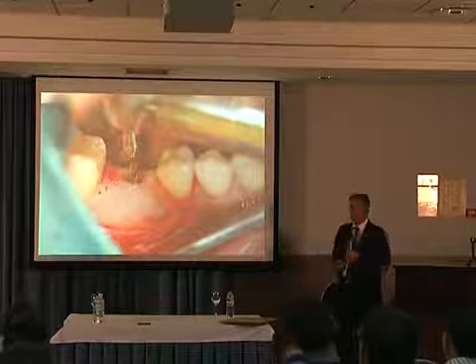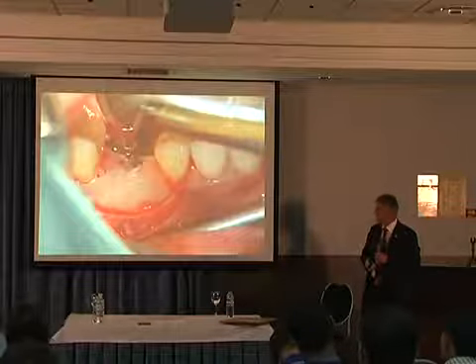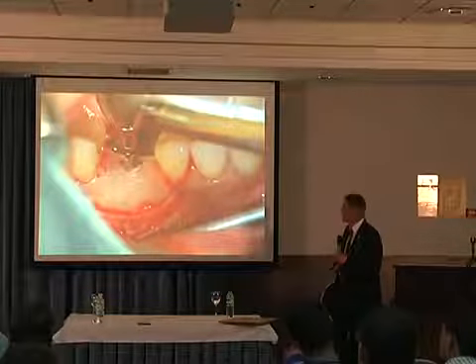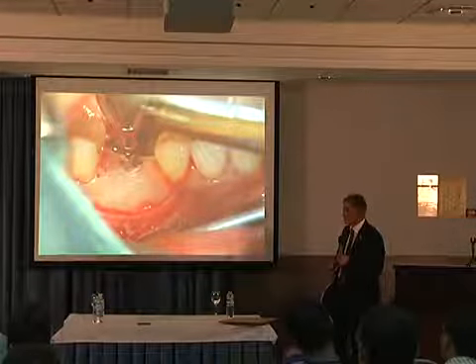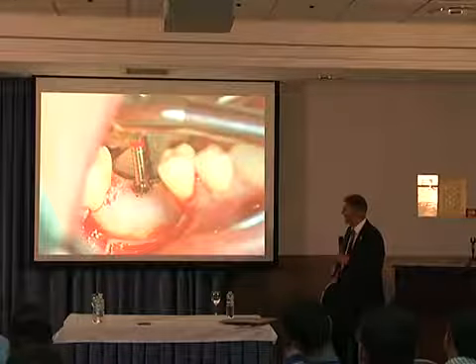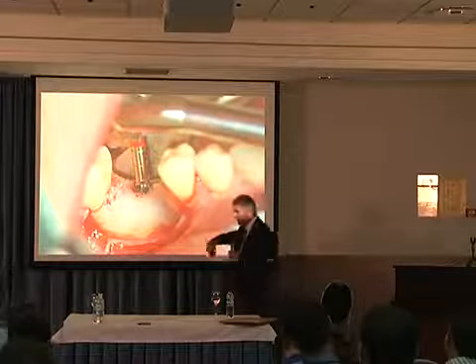Okay. А когда заканчивается расщепление альвеолярного отростка, то согласно диаметру имплантата он идет либо пилотом и потом окончательным бором, а если расщепился достаточно, то можно идти финишным бором. This is the first, number one, number two. Первый и второе сверло. Thread cutter. Okay.